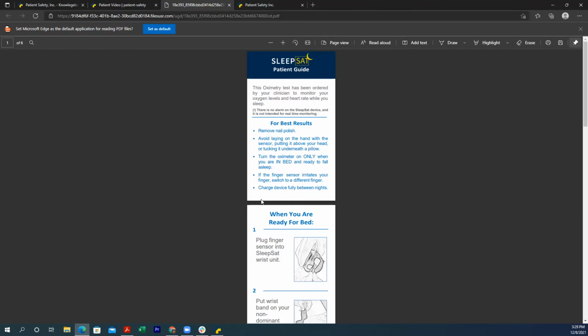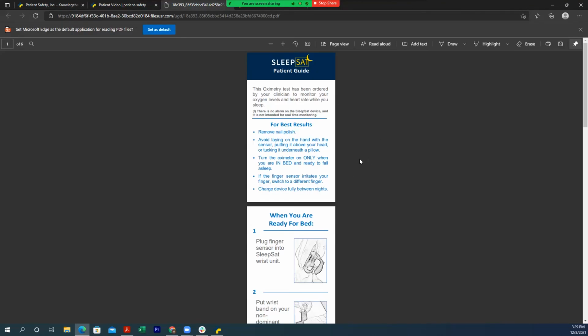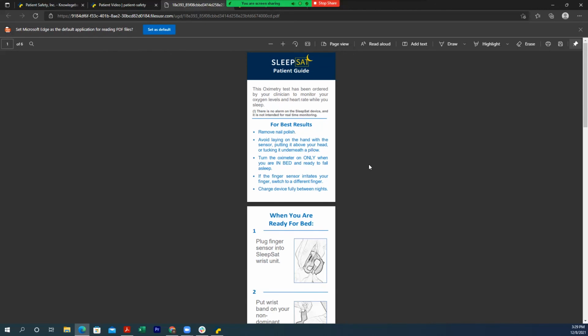My pleasure. I have another question on can we get more copies of the sleep study insert that came originally? So, I believe that you're talking about the patient guide. And if you're not, please let me know. But if you're talking about the SleepSat patient guide, that can actually be found really easily using sleepsat.com/patient video, under here where it says click here to download. That'll bring up the patient guide that's printable at that point.